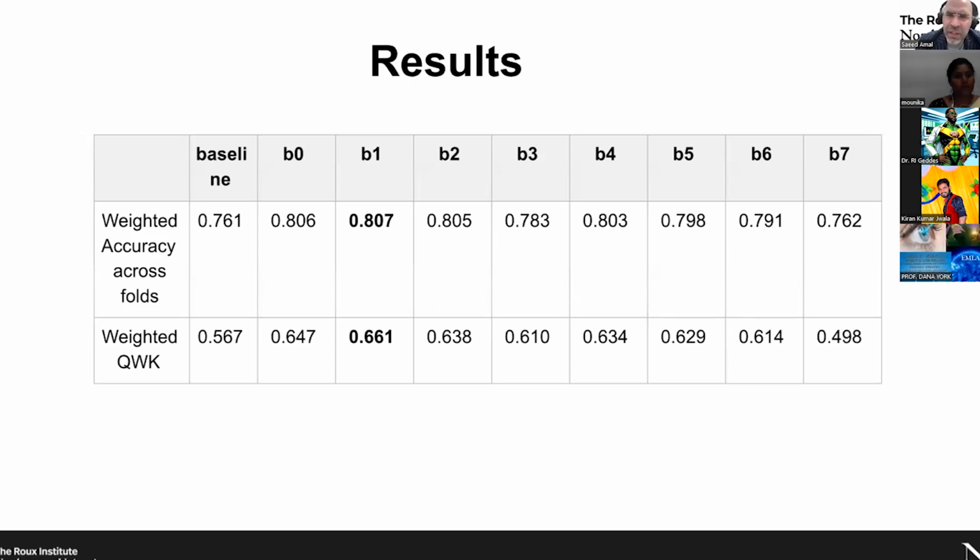So here we can see the different versions of the EfficientNet, and we can see the baseline. So we trained the state of the art that was published in the literature, and we trained it on this large scale dataset because many research works would use their own dataset and evaluate on their own dataset. But then when it's externally validated, also here as Dr. Jürgen mentioned, we need models that can perform also in the real world, and when evaluated on an external set, would be reliable to be used in the real world and beyond the report of the research.